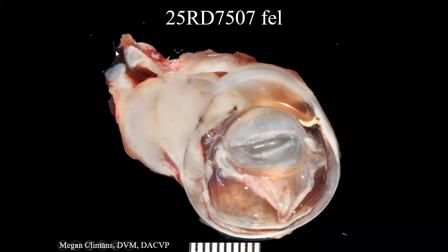Here's where the palpebral fissure is. Here's eyelids. So this is all bulbar conjunctiva and episclera, which is expanded by this tan white mass. Here is iris on that side, which is also expanded and distorted by the same mass. It's also involving ciliary body through to choroid back here. The choroid is still thickened and tan over on this side. And this iris is looking at least slightly more normal, comparatively speaking. We've also got a fairly cloudy lens, and we've got a detached retina, which you can see back here.